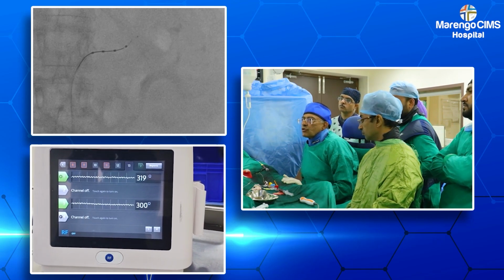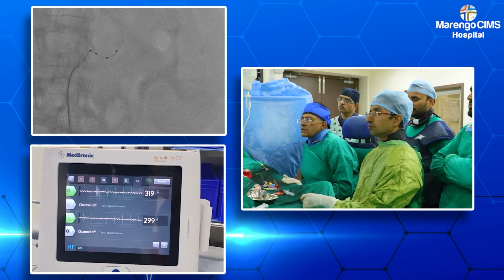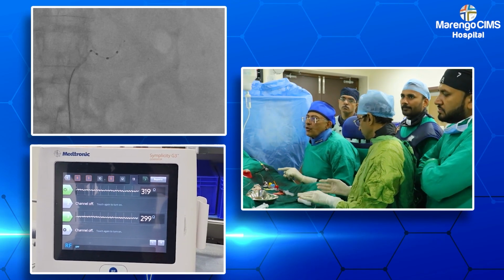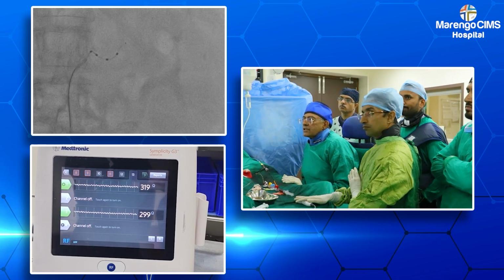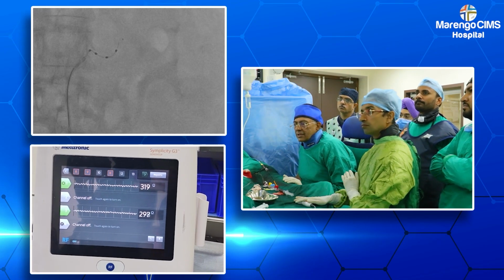The 2nd electrode is right at the carina of the inferior branch which we just ablated, so that should be switched off. And the 4th proximal most electrode is right at the ostium, which should be switched off. And since the 1st and the 4th and the 3rd electrode are 5 millimeter apart, the 3rd electrode is in a very ideal position, 5 millimeter from the ostium. So I think we'll go ahead and do the last ablation.